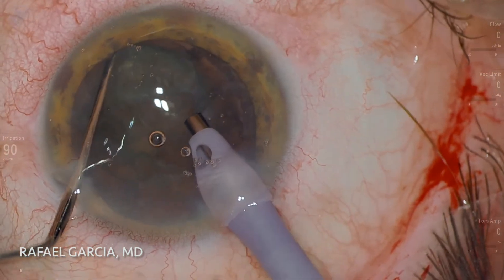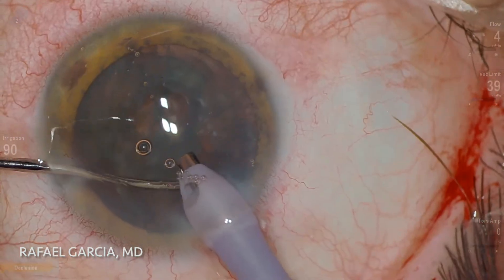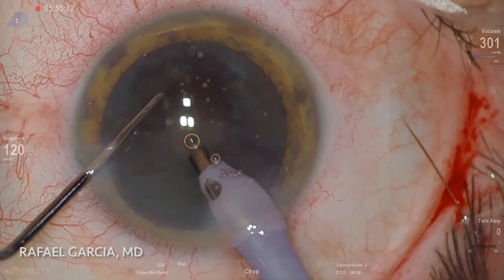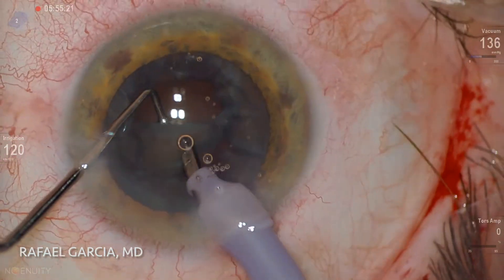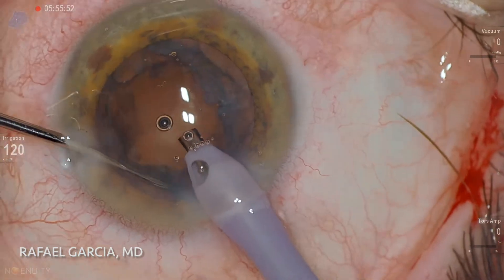After that, the nucleus is rotated with the chopper and some fragments of this soft lens start to come forward in a somewhat clumsy way. This is definitely not my most efficient case in terms of nucleus division. So we'll just accept that and use the phaco probe to emulsify these pieces.